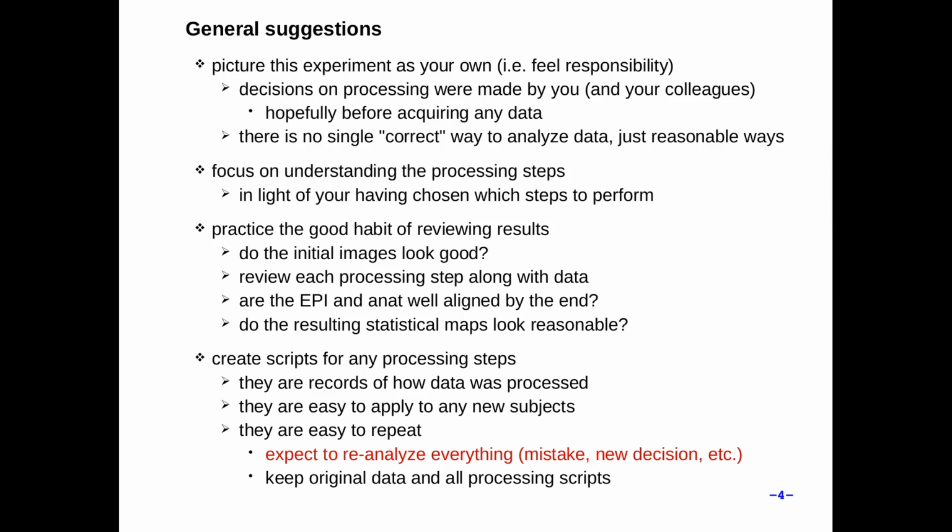So for this data analysis that we're going to run, you might picture this experiment as your own. Feel some responsibility in how it's being carried out, including the choices that are made for processing. And you might imagine you're entering a new lab, for example, and you're going to help run an analysis, so you have some data in hand, but you want to view the choices for the analysis that are made by you and your colleagues as ones that you feel justified in using.